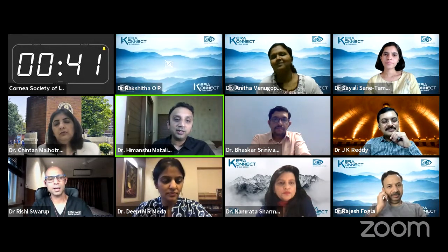Okay, great. Also, before we remove that, whenever there is a free cap, keep the flap right in place on your microkeratome, because you will know the site there and you can just slide it onto the surface. I think we move on with the next case. A couple of points, Himanshu. Hi. Please, Dr. Rajesh, go ahead.